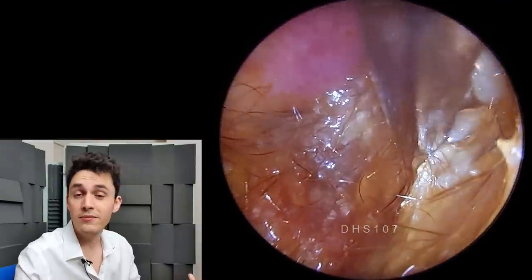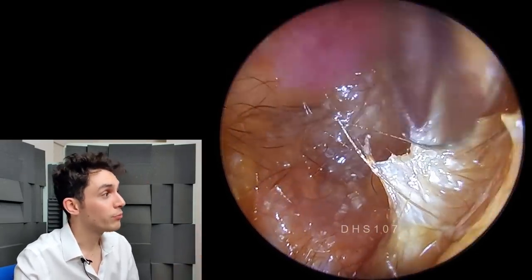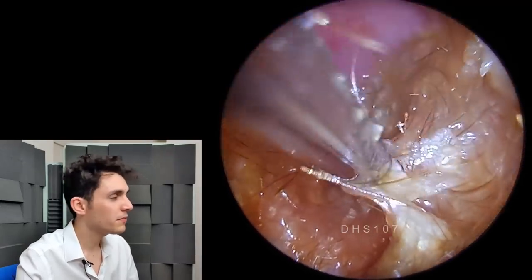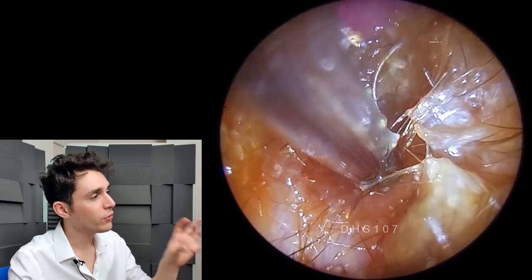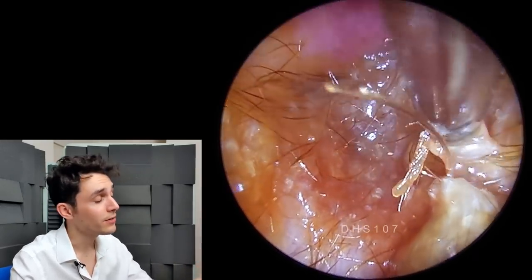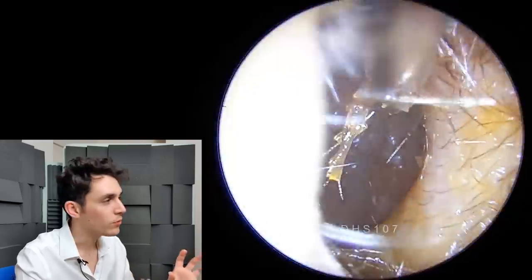In cases like this, I often use a combination of suction and irrigation. In previous videos you will have seen me use a squirty bottle, which isn't that good. But the Guardian Projet really, really improves the situation. I got it about six months ago and I've been very happy with it. What it does is, first of all, it affords me a little bit of position — the irrigation will clear the ear canal and just allow me to judge the anatomy a bit more clearly.